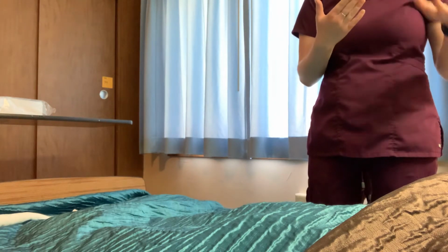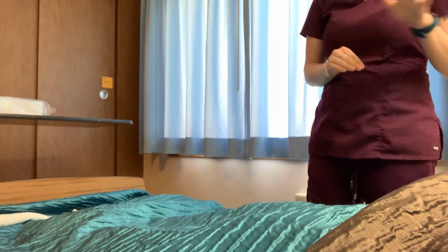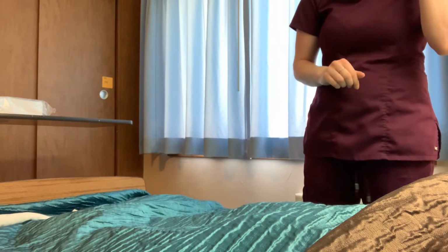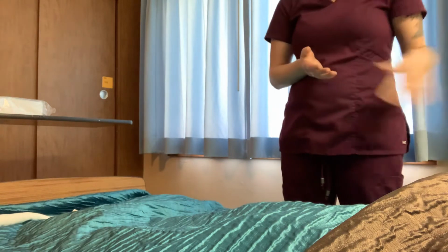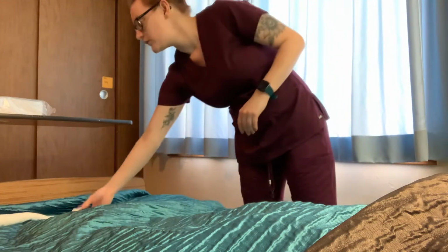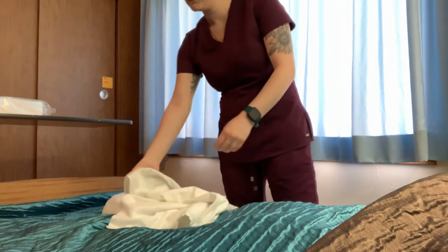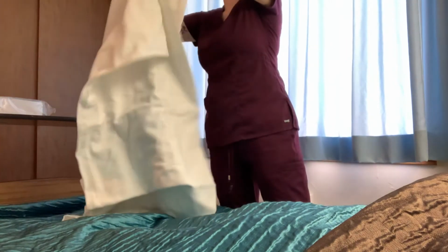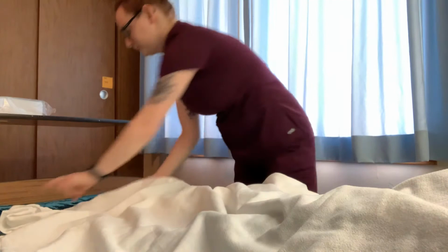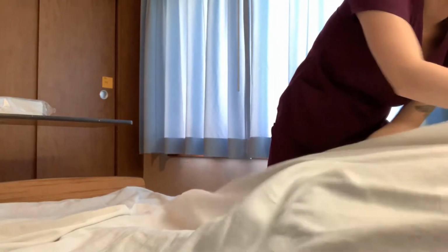So this is Edna. Edna, we are going to put in a catheter today. I will explain every step that we do. So I'm going to provide a bath blanket here for you. And I'm going to take down your blankets.